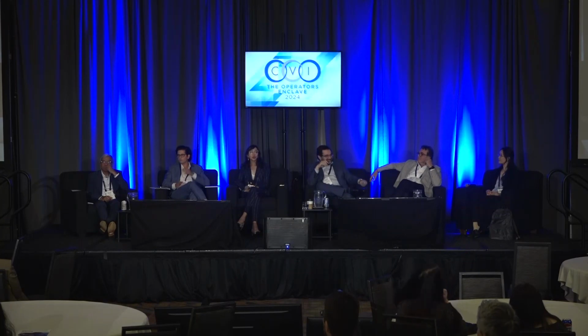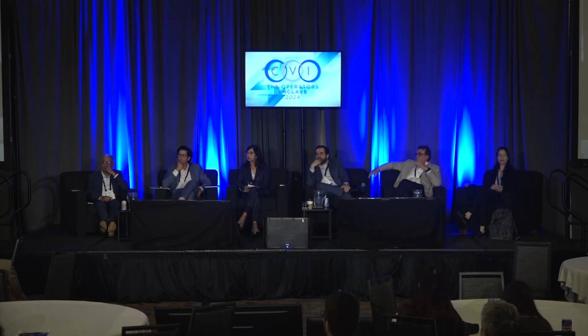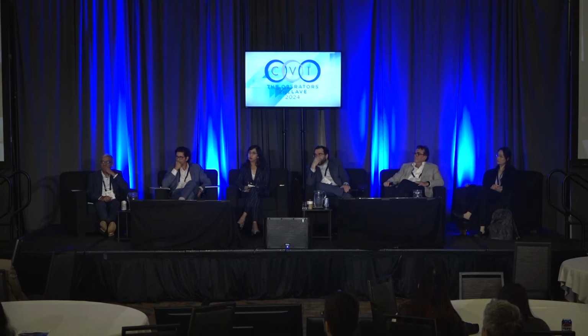Our EFS data were presented at TCT. We look at leaks less than 3 millimeters and greater than 5 millimeters. In the initial EFS series, we had a few less than 3, and we had 1 over 5. So there are a few leaks, but with those leaks, we've not seen any associated DRT or clinical events. I do think the leaks that we see are going to be different, but you're going to need a lot of patients to prove that. They're not mechanistically the same as other devices. There were 50 patients in EFS.